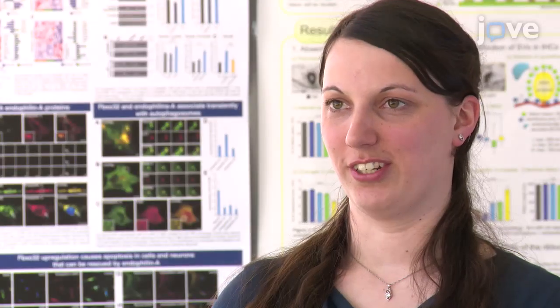When attempting the procedure, it's important to remember that the most critical step is the recording of the original video. All further analysis depends on good quality videos. Gait analysis is a useful method to characterize gait and motor behavior in mouse models of neurodegeneration. However, some aspects of motor behavior, for example muscle strength, are not adequately assessed by this method. We therefore recommend complementing video-based gait analysis with a battery of other motor behavior tests like grip strength, rotarod, and beam walking. After watching this video, you should have a good understanding of how to perform gait analysis in mouse models that develop motor impairments with aging.